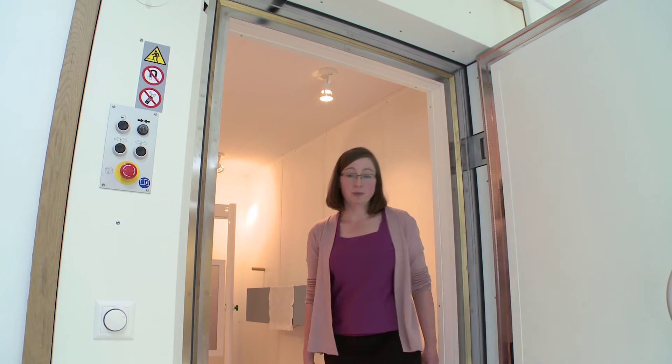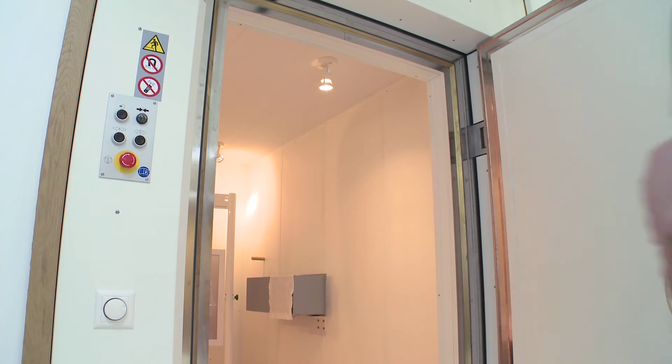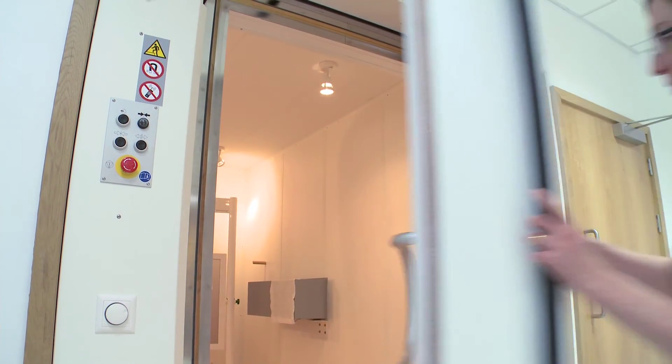I'm going to close the door now — it makes a bit of a funny noise — and now we're ready to do our recording. We're back over at the desk, and from here we can talk to Stefano through this intercom and see him on this video screen. On this computer over here, Elaine is recording Stefano's brain activity, and it's this recording that we can use to find out more about where in your brain your seizures may be coming from.